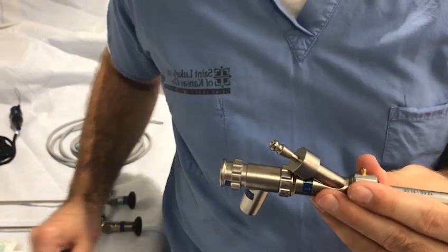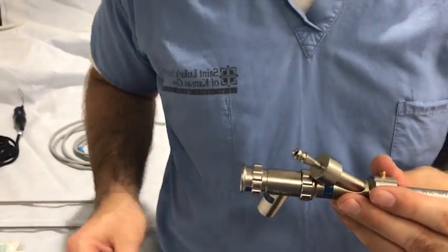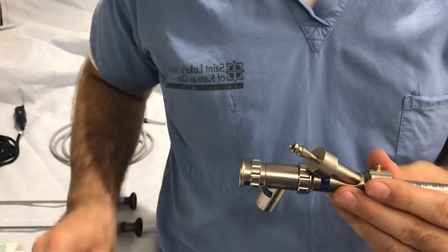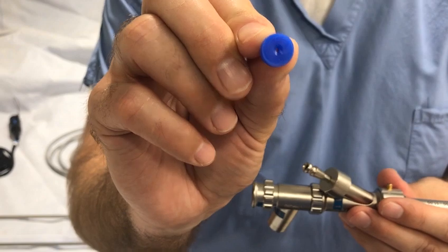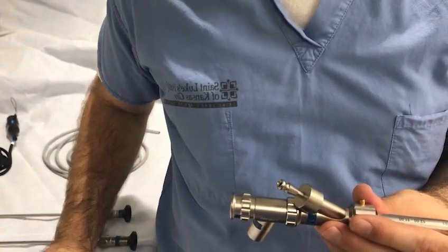A silicone blue cap is then attached to the accessory port. This cap can have a hole to allow passage of a suction catheter or forceps, or may not have a hole to help facilitate a closed ventilating system.